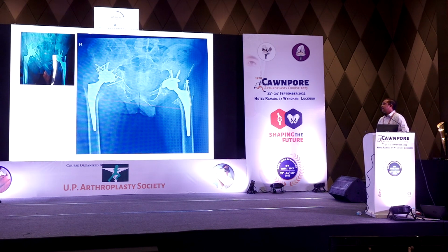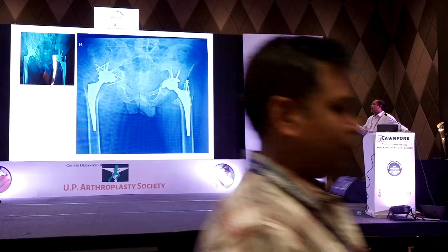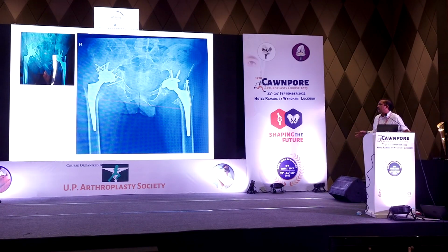Regarding the knees, you just used a PFC knee, isn't it, sir? Could you actually straighten it out from 120 degrees? Sir, we did 30% correction pre-operatively by hamstring tenotomy, traction, and serial casting. That was time-consuming for the patient. But even then, you have a deformity of like 75, 80 degrees. Yes. Then we corrected about 60, 70 degrees intraoperatively, and the rest by physiotherapy.